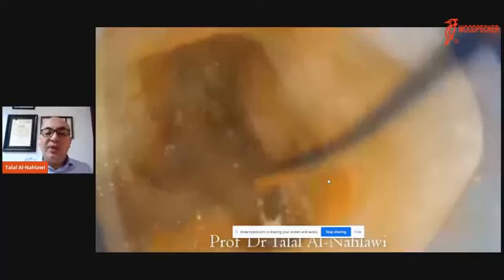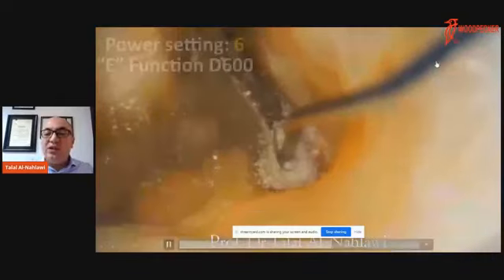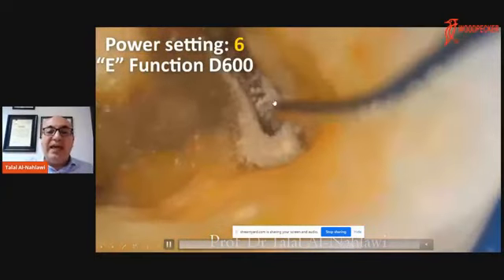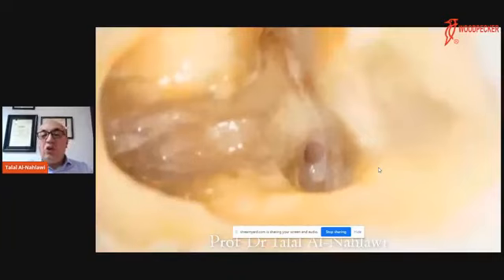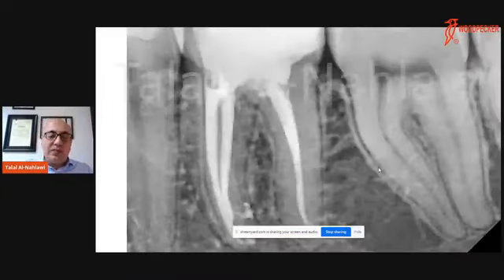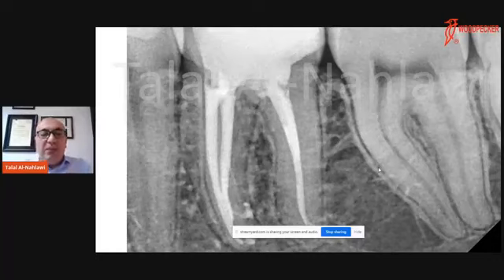And I can work with a sweeping motion, as if I am trying to remove the calcification. And please note the multidirectional curves that you can make with the stainless steel, thanks to the stainless steel material and thanks to the cutting efficiency that you can direct. And then after that, I was able to remove the 1 to 2 millimeters of calcification in the coronal area till I got the catch at the beginning of the canal, and I was able to continue the instrumentation without further removal. You can see that I was able to work on the coronal part using the T1 ultrasonic tip by directing it, getting the benefit of the direction of the tip because it's stainless steel.